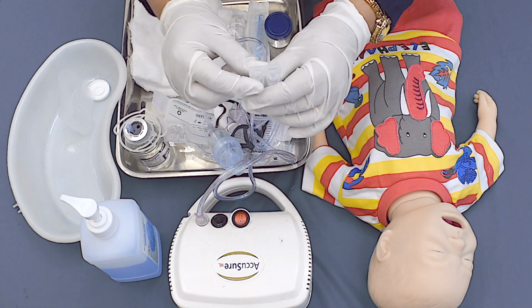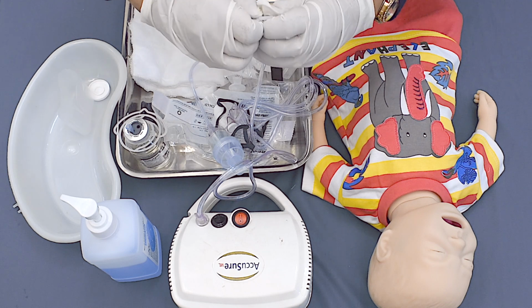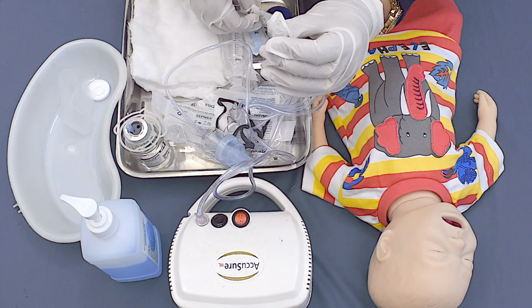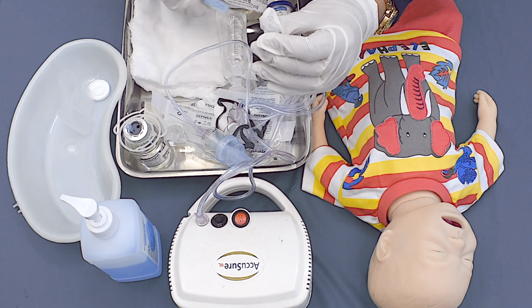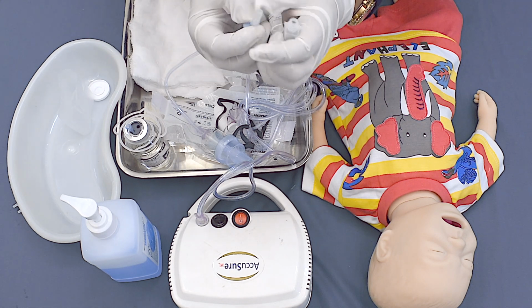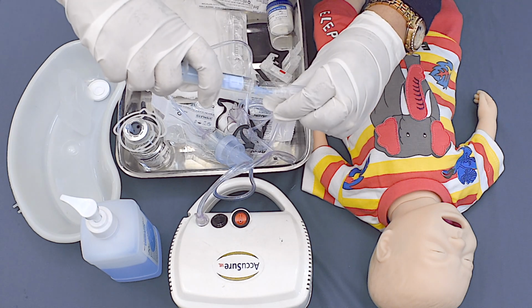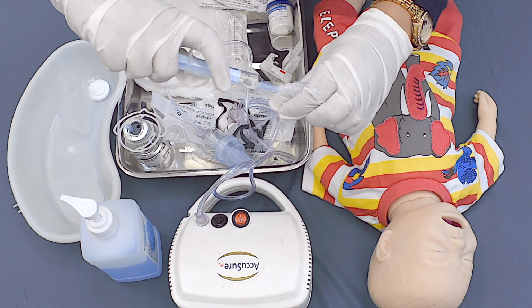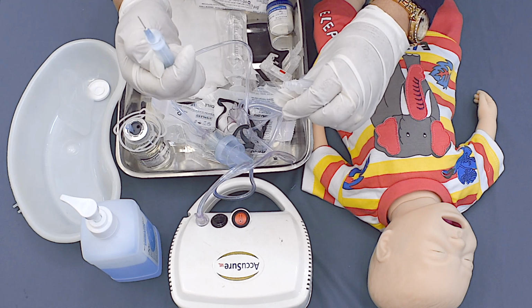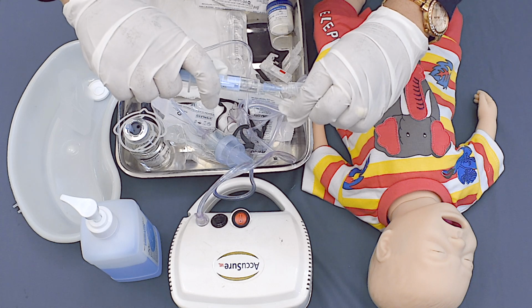Open the respule of the prescribed medication. The medication has to be withdrawn in the syringe. After taking the prescribed amount of drug in the syringe, the medication has to be poured in the nebulization kit.